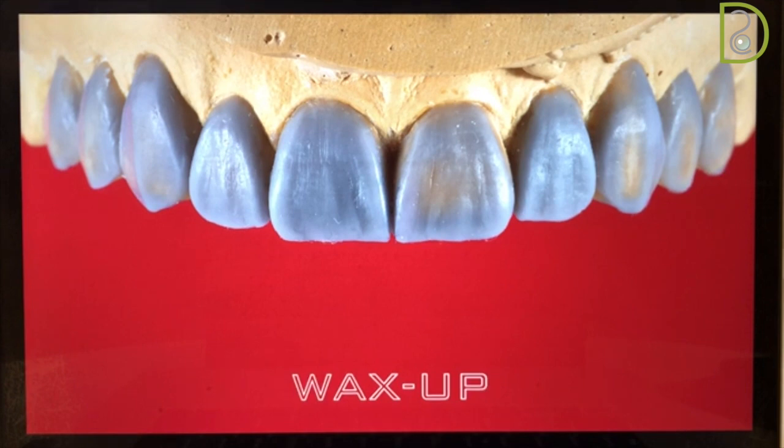Each case has its own requirements. In one patient you might need to increase the incisal edge, in another patient you might not need that, in another patient you need to fix alignment, in another you need to close spaces. So it depends on each and every case indication. This is the most important part that you need to keep in mind.